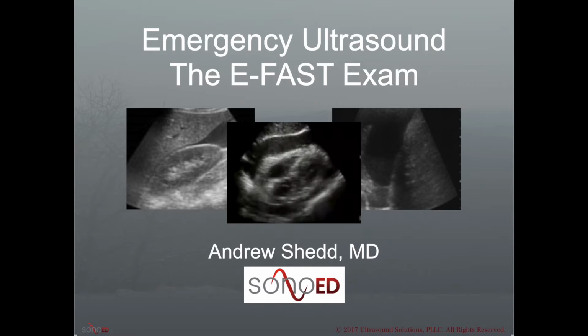If you haven't listened to that yet, or if you're new to ultrasound, I would recommend you go ahead and listen to that one first. It's only about 15 or 20 minutes long, but is a good introduction to ultrasound and how we're going to use it in the emergency department.